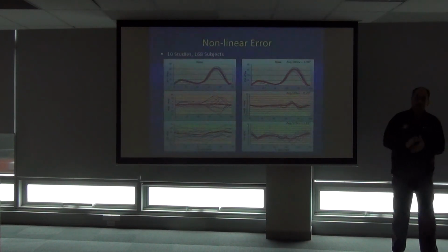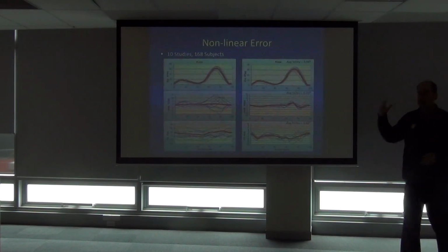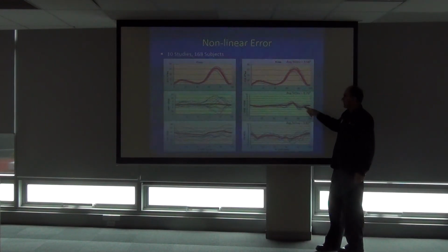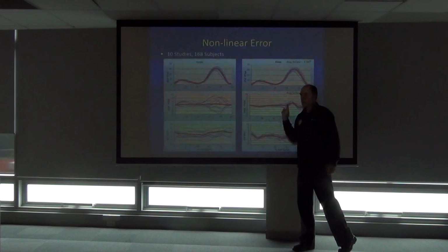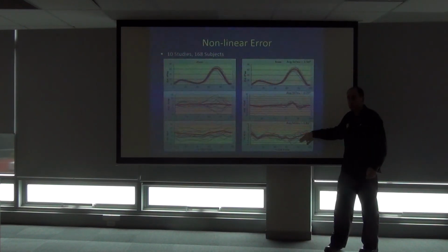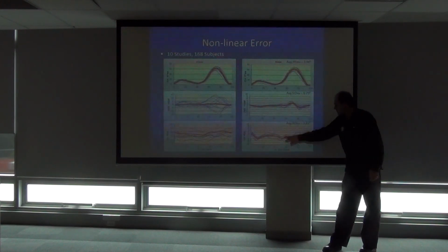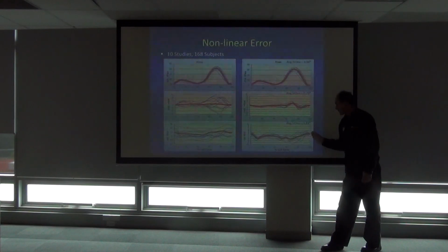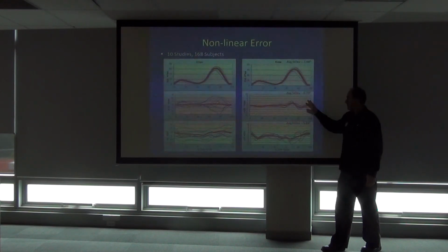That is not ideal, but you can see that we have produced these characteristic, more common curves, though they're not quite so common. Again, we look at stance and swing, and swing has a bit more going on.